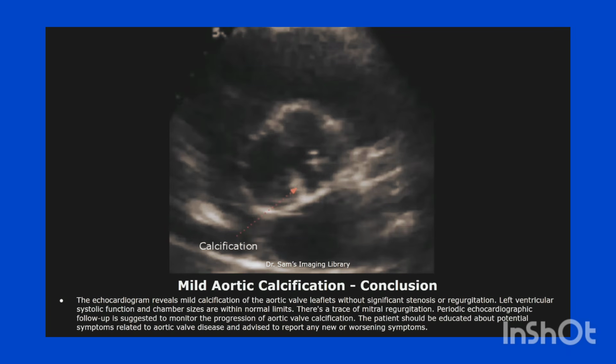Periodic echocardiographic follow-up is suggested to monitor the progression of aortic valve calcification. The patient should be educated about potential symptoms related to aortic valve disease and advised to report any new or worsening symptoms.